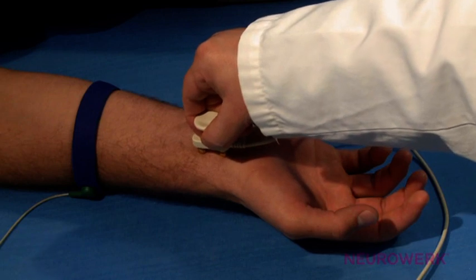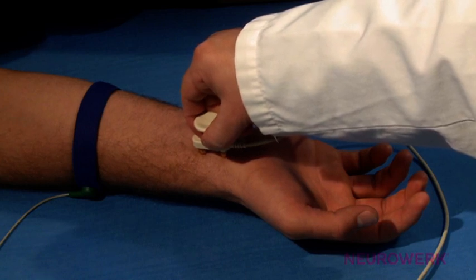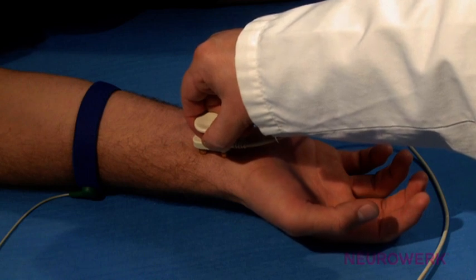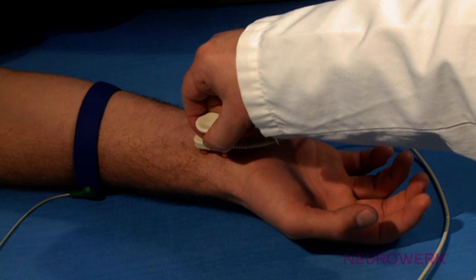The stimulation place for the SSEP of the median nerve is determined in the same way as is the case with the electroneurography of the aforementioned nerve. Therefore, it is above the median nerve at the wrist. It should be noted that the cathode of the stimulation electrode points to the proximal, towards the head. The ground electrode is attached between the stimulus and recording electrodes. It should be noted that these should always be moist and tight-fitting.